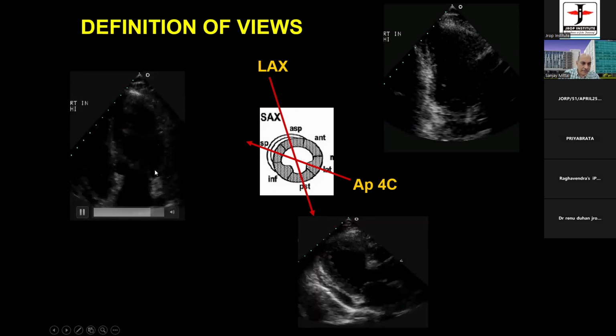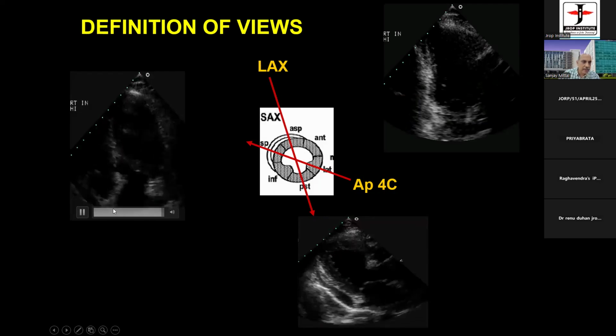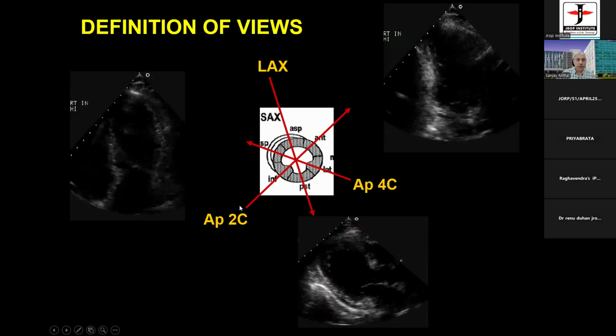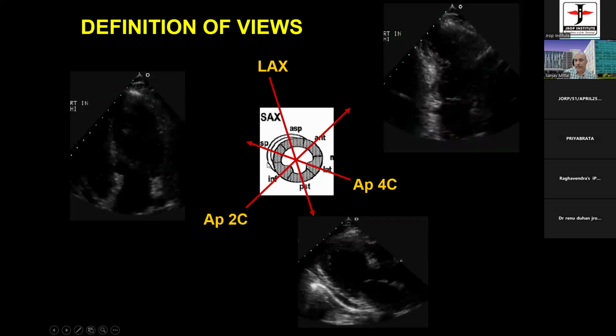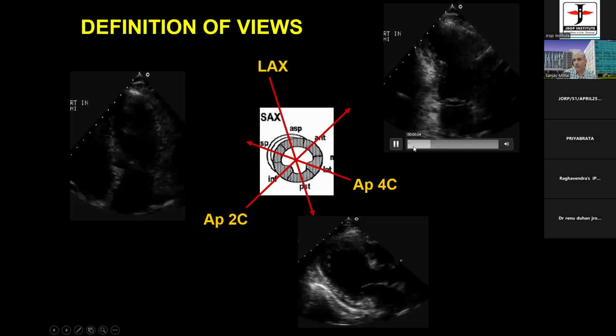So we would have the basal lateral, mid lateral, and apical lateral, basal septum, mid septum, and apical septum in the four-chamber view. Thereafter, when we twist the transducer 60 degrees, we lose the right ventricle completely. This right ventricle would not be available in the two-chamber view.